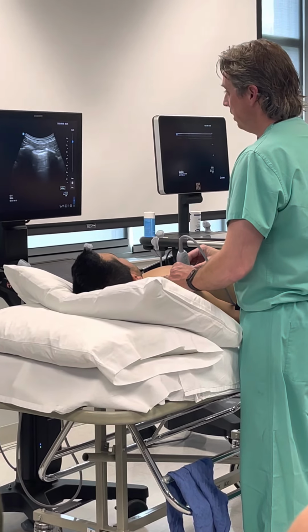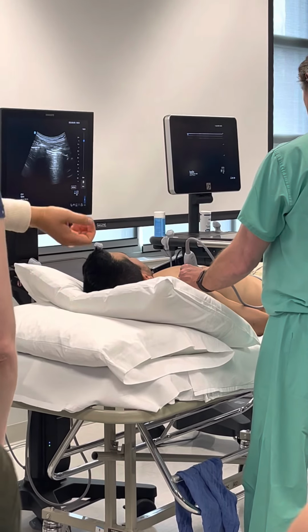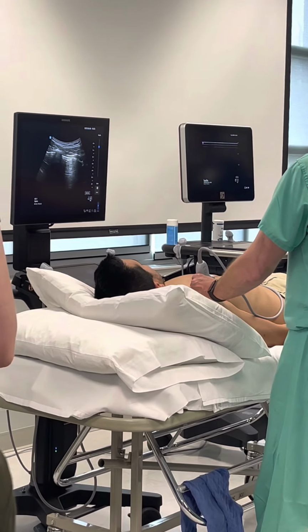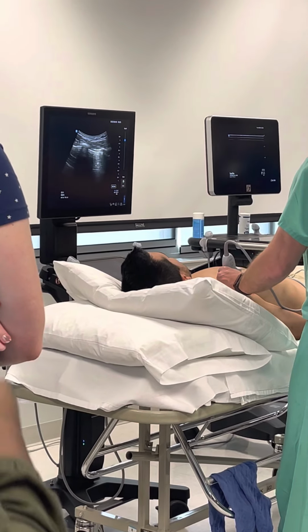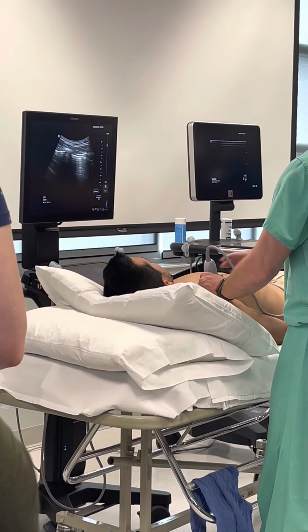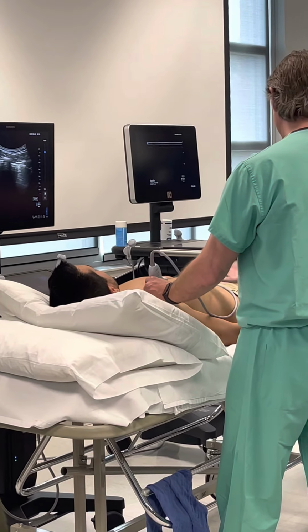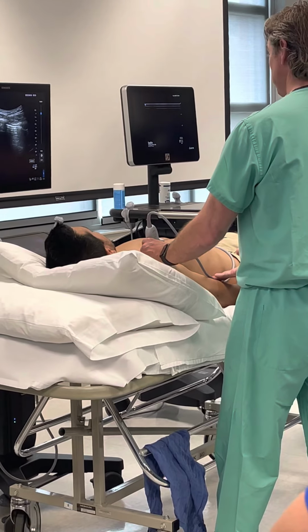So when we're looking to find that, we want to systematically assess the lung fields, right? With him sitting in a slight head-up elevated position, if he did have a pneumo, we would probably see it in the upper lung fields, right? Air is going to rise. If you think he's got a collection of fluid, where would that necessarily go? We're probably going to look for it laterally or almost posteriorly in the pleural fields.